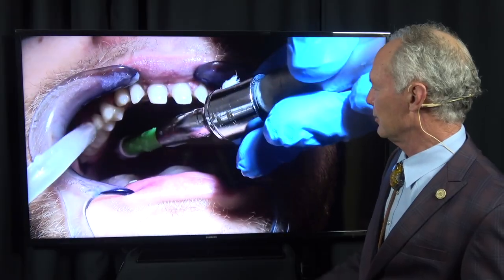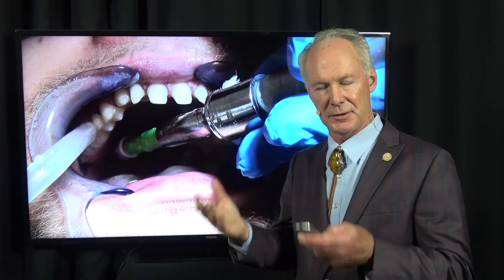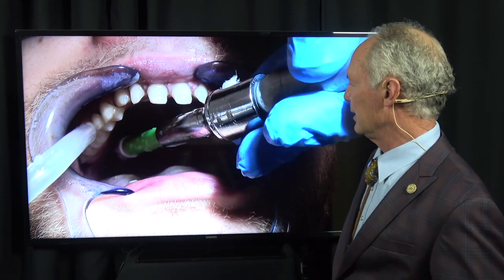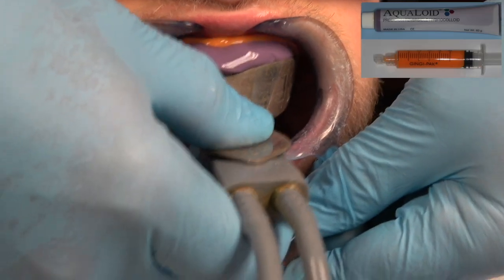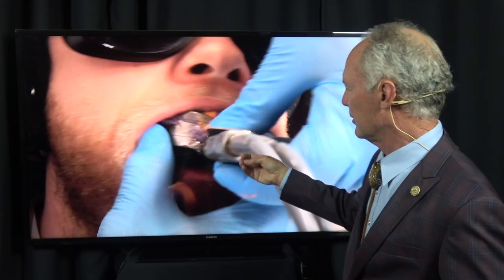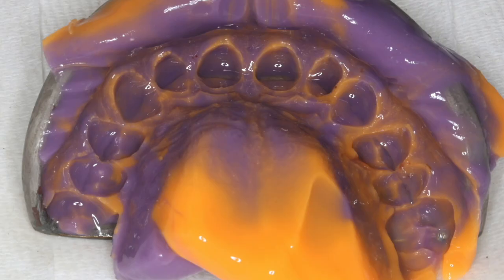Then I chase it with a reversible hydrocolloid impression. It sets up when cold water runs through the channels that connect to the tray. The trays have channels in them, and then it gets soft again if you heat it up. So you put it in warm, and then the channels of cold water run through the tray and make it set, and it's deadly accurate. This is a hydrocolloid, but to use hydrocolloid, you've got to have these channeled trays and a hose set up to your operatory chair.